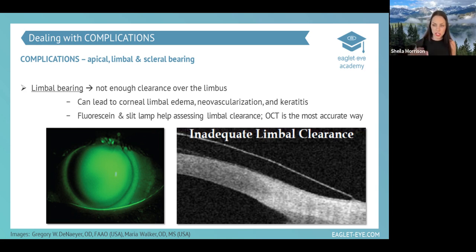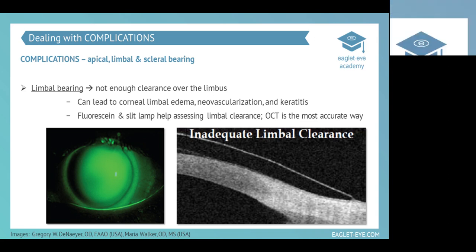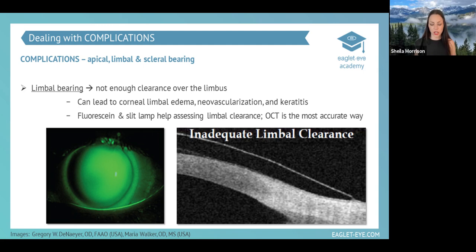The lens is actually touching down a little bit inside the limbus. And so not only are we touching in an area where we have corneal sensation, so patients are definitely less comfortable, we are also creating areas that can trigger things like limbal stem cell deficiency and create disease in the cornea, or defects in the cornea related to the fluid pumps. And ultimately, we're creating a situation that could end up in an unhealthy cornea.